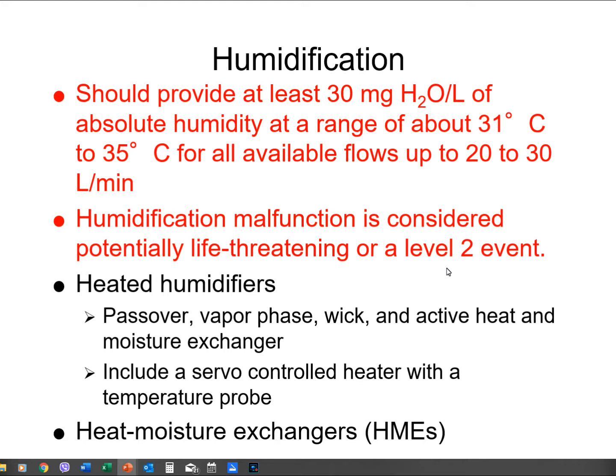If they're starting to get clogged, you can just flick the HME in the trash can, get all those secretions out. Or if it's really, really caked, change out the HME. You can potentially kill somebody with the HMEs if they're totally clogged and you have no way of air passing through the HME. You can basically suffocate the patient and kill them. So just be careful with the HMEs.